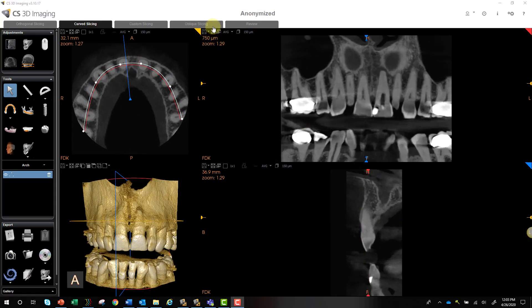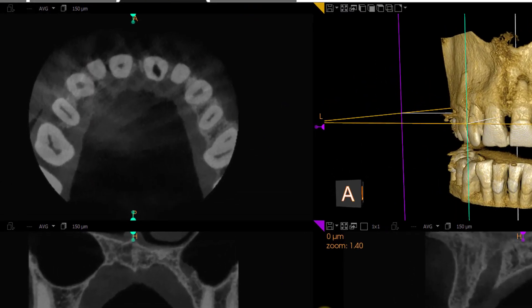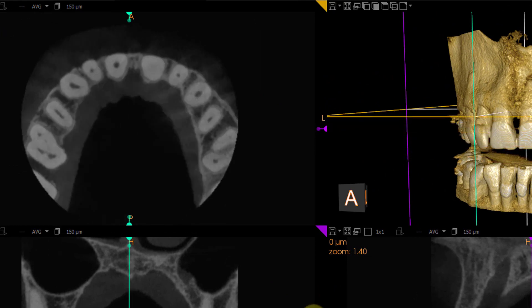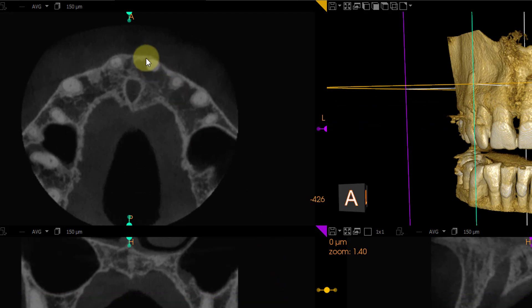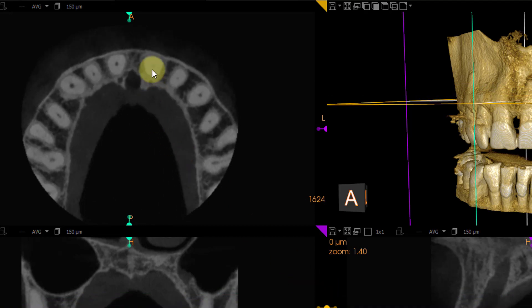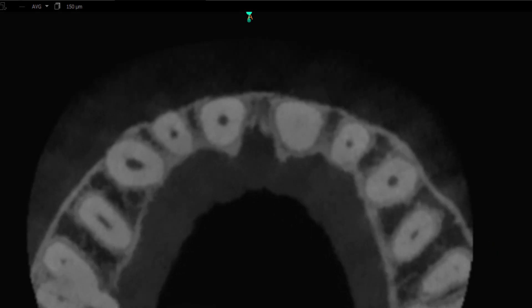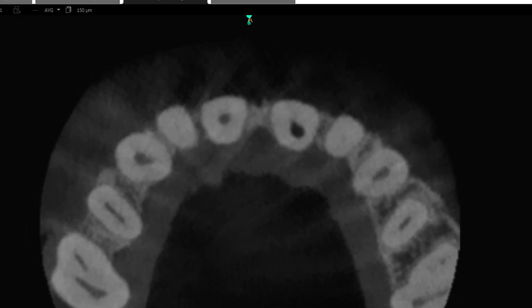We can now move to the Oblique Slicing tab. Let's go ahead and slice through inferiorly to superiorly and get an overview of what's happening in that area as well. We can see the area of low density surrounding the apex of number 9. Slicing superiorly, we can see the actual canal and we can see the actual axis — the end of the axis.